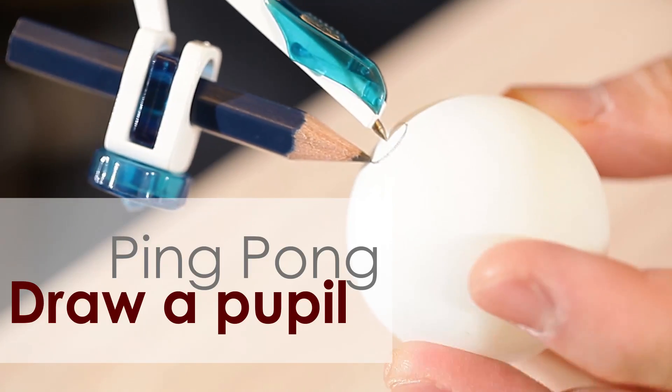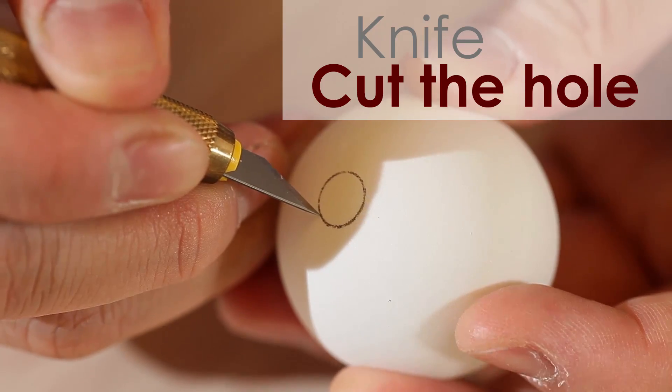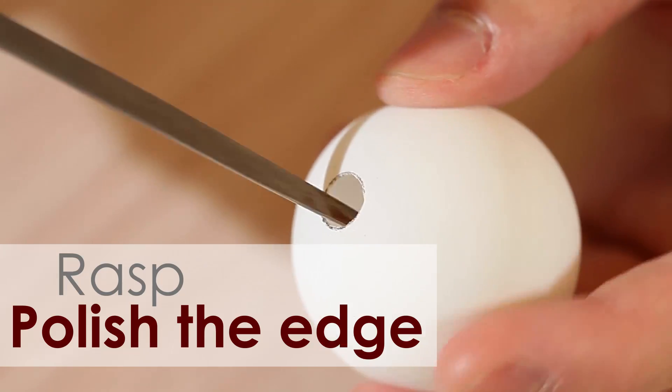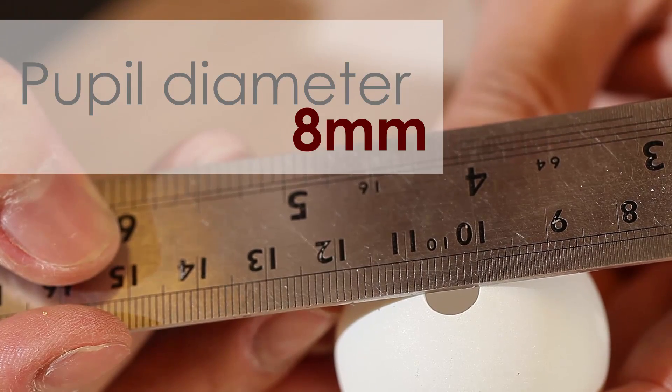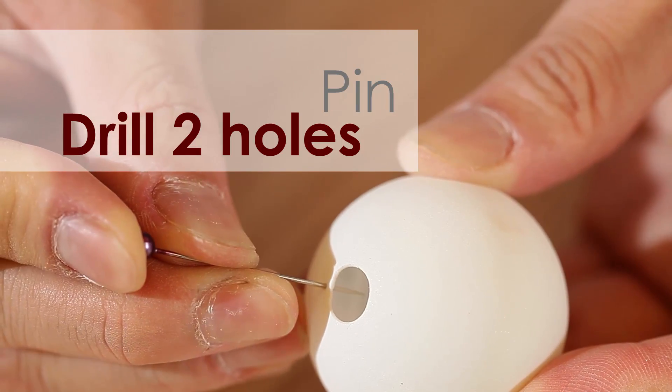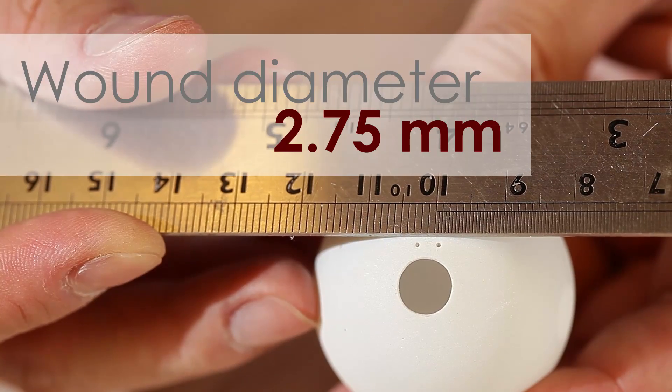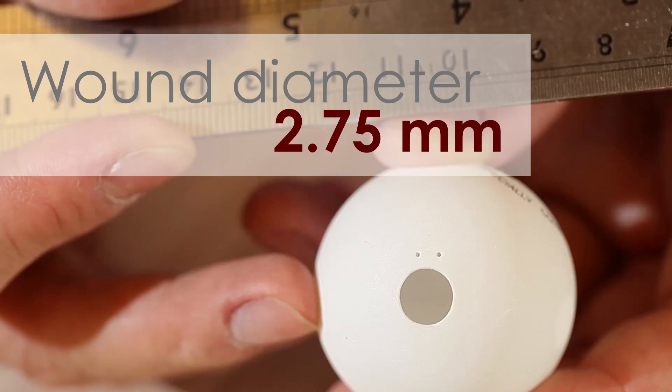Using a compass, draw a 3.5 mm circle radius on a ping pong ball. Cut a hole, then polish the edge. The hole should be 7 to 8 mm. Using a pin, drill two small holes next to the wound. The distance between the two holes is 2.75 mm.